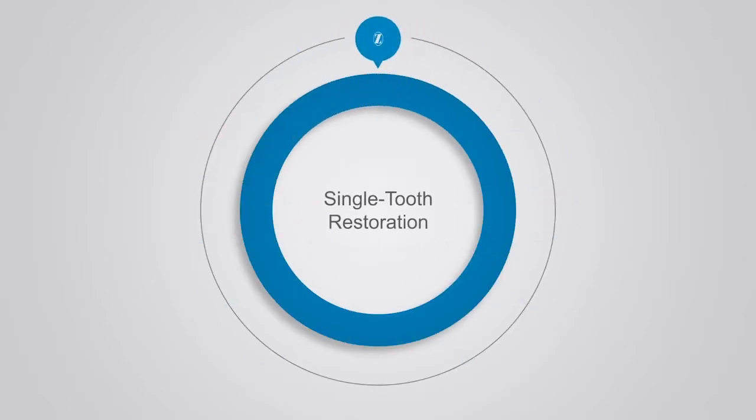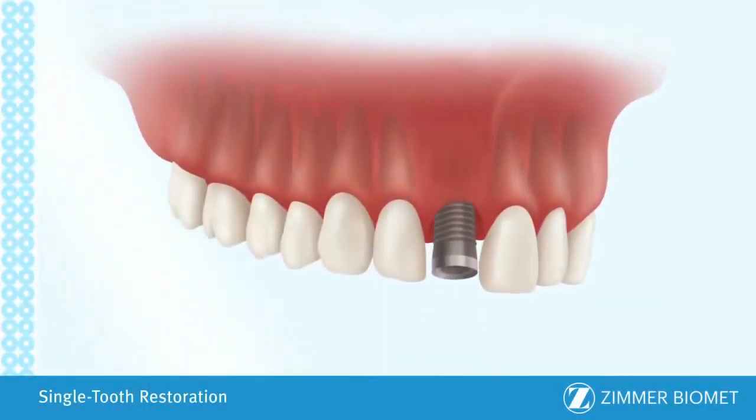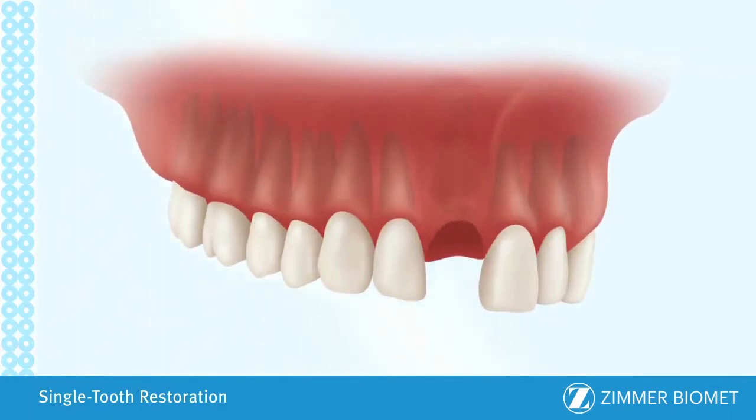Single tooth restoration. The single tooth restoration is used when one tooth is missing. Depending on the location of the implant, it may be placed at a slight angle to utilize as much available bone as possible. The implant may be left to heal for up to 2 weeks or for a few months, depending on bone quality. Following healing, a titanium post is screwed into the implant body.